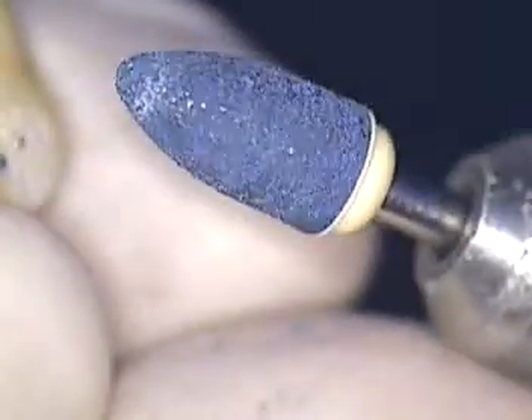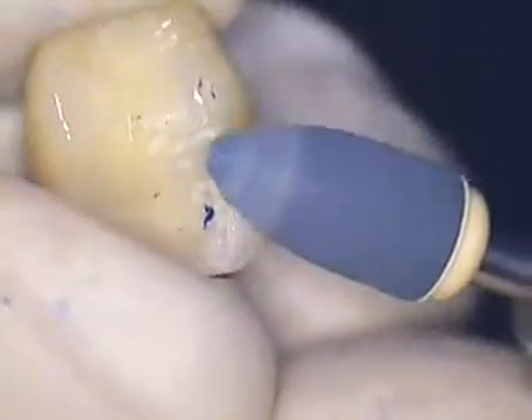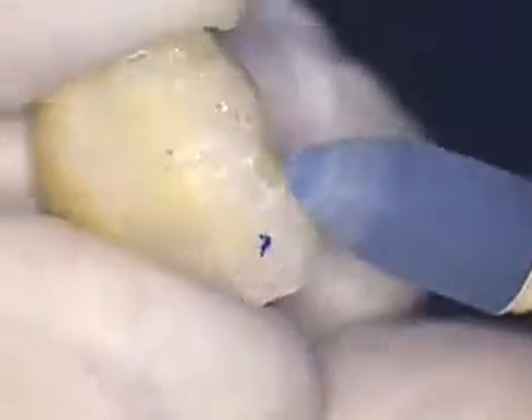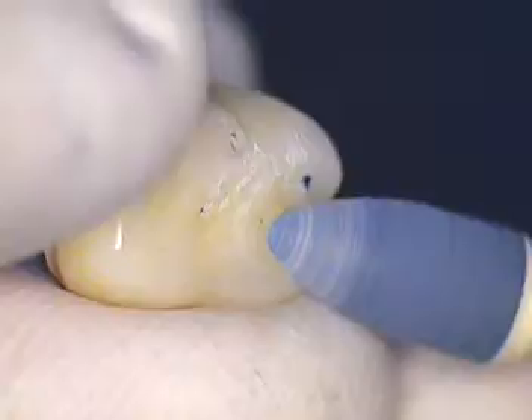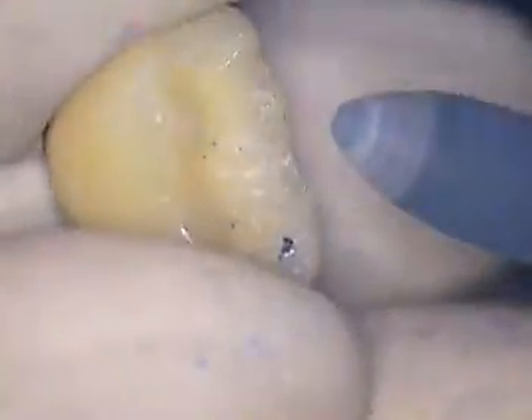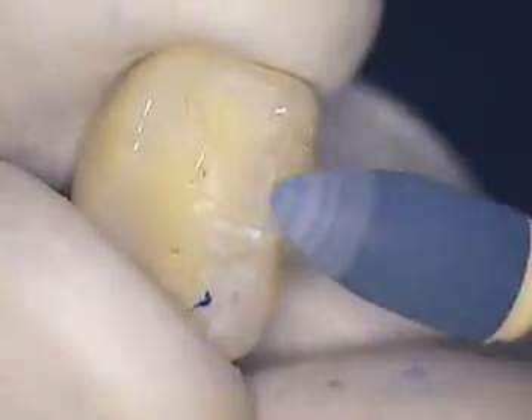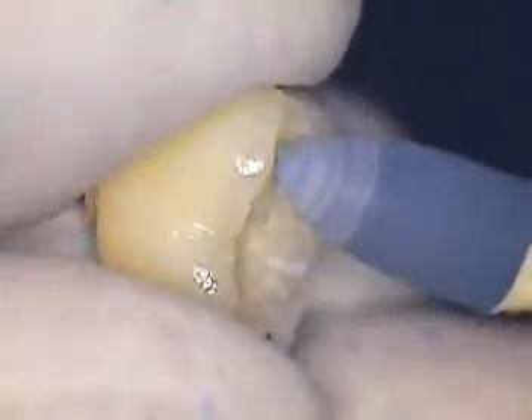All right, here we are back again live. I'm going to show you how I do a little polish with some abrasives. We're going to go right around this area. I'm going to use a little coarse compound — I believe this is a Comet polisher, a rubber polisher. We're going to do those areas first, those inclines.